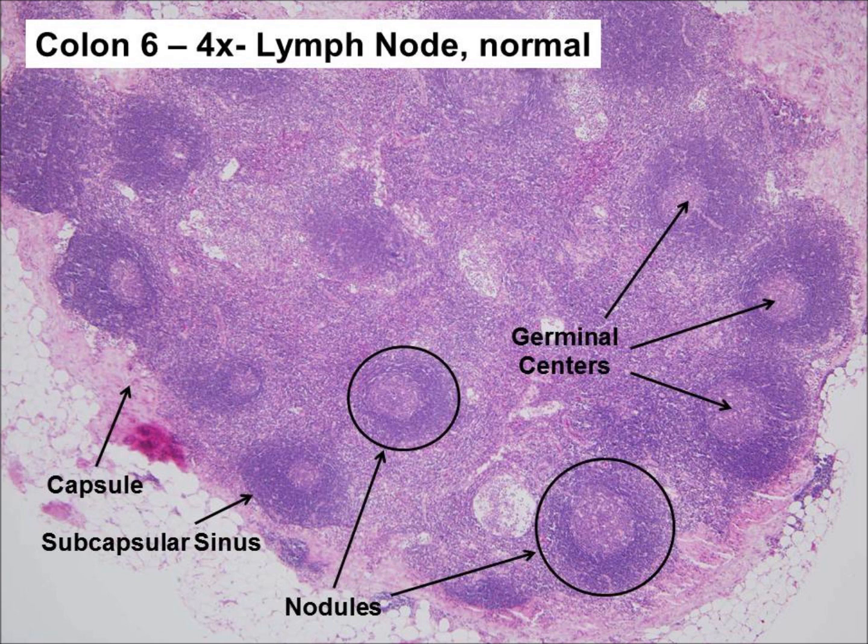And finally, note the size of the germinal centers relative to the entire node. This will be important later on in distinguishing normal morphology from pathology.